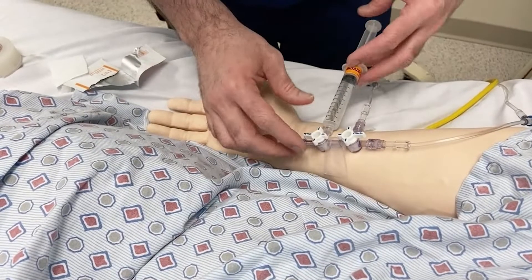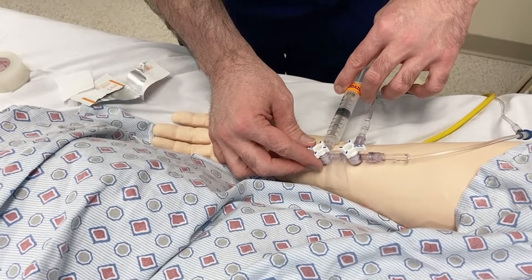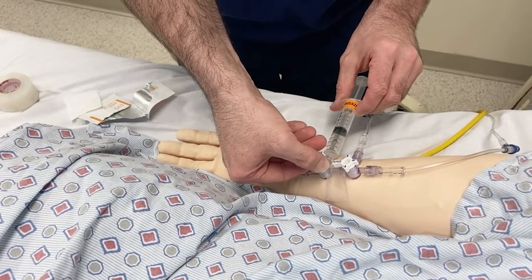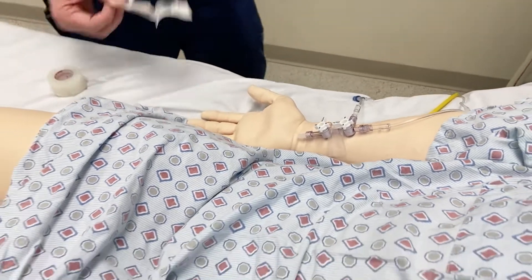Hello YouTube. My name is Clinton Clegg. I'm a simulation specialist here at Wiser. I'm here to share some tips and tricks for managing and maintaining a variety of simulation equipment at your simulation center. Today, I'm going to share a handy little system that has been used here at Wiser for many, many years.